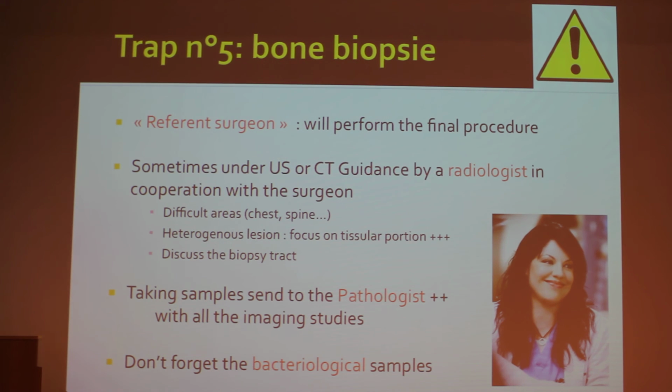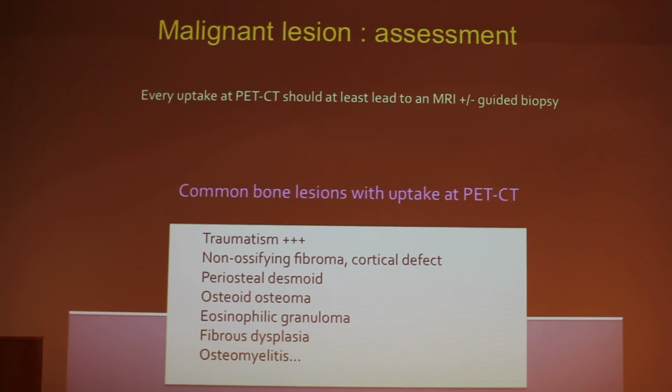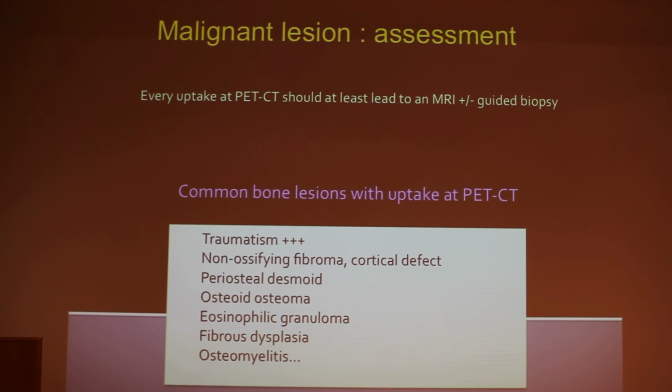So that's it. And then your next friend you have to call is the pathologist, because especially in bone tumors, pathologists need all the imaging clues to make the right diagnosis. Sometimes it's really tricky to make the perfect diagnosis, and they need to have some information about the features and X-rays and MR. The assessment must also be general, including PET-CT. PET-CT is mostly useful for the metastatic status.